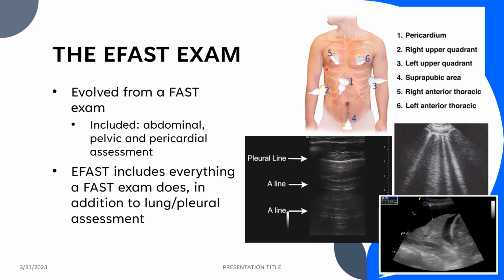But then you're going to need to work your way up the rib line here, up to the apex, and evaluate the lungs in multiple regions to determine whether there are any issues. The other thing to be aware of is that ultrasound does not do well looking through lung tissue that is aerated. So as you're scanning through the front of this patient's chest, you're going to be very limited in what you can see in the back of the patient's chest.